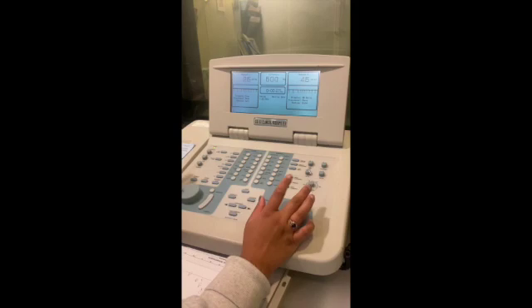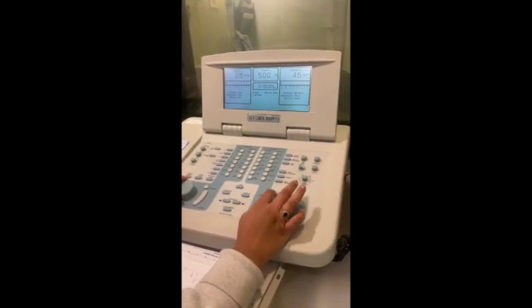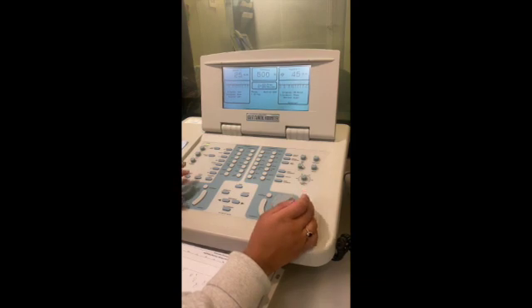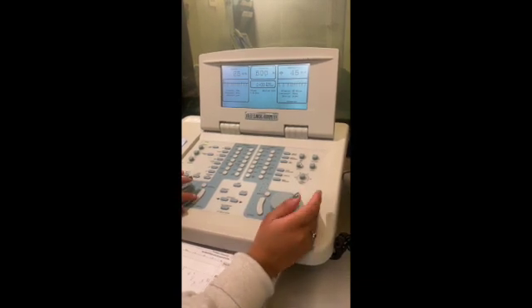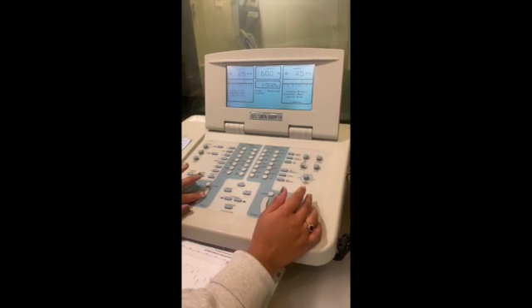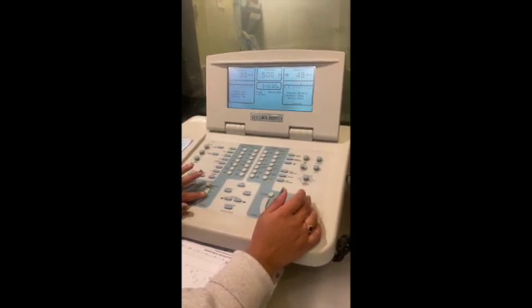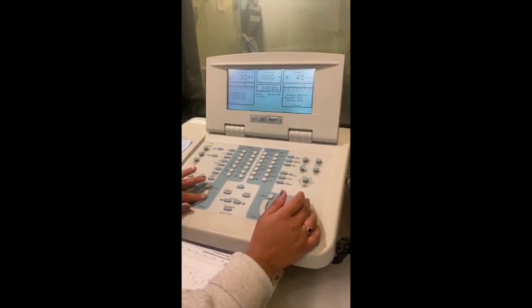Okay, so we're going to begin masking. Make sure your channel 2, your right ear, your non-test ear is on interrupt. So now we're going to begin presenting the tones. So I'm going to present the tone to the patient. They didn't hear the tone, so I'm going to raise this 5 dB. Present it again. They heard it.